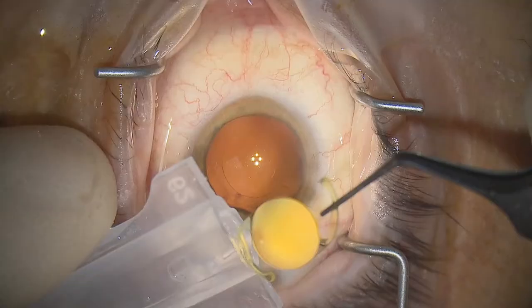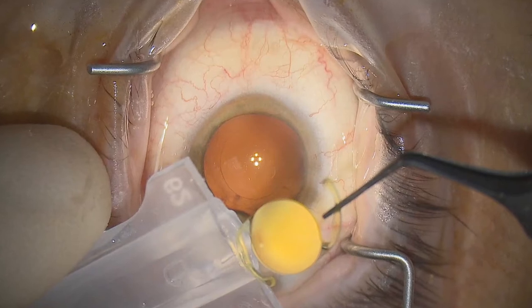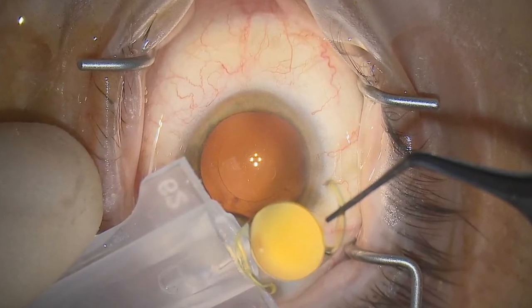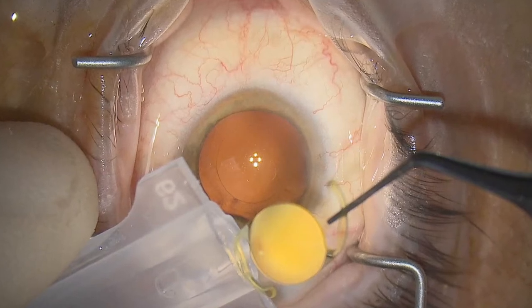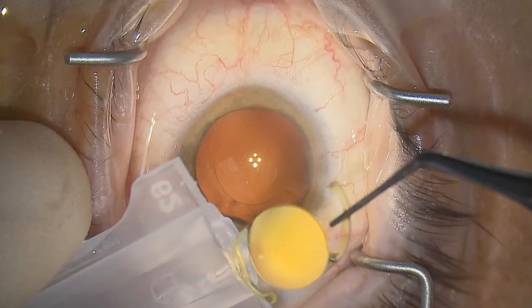We're going to concentrate on a one-piece C-loop hydrophobic acrylic lens platform and a fairly basic, widely used injector system: a screw injector with a 2.2 millimeter cartridge.